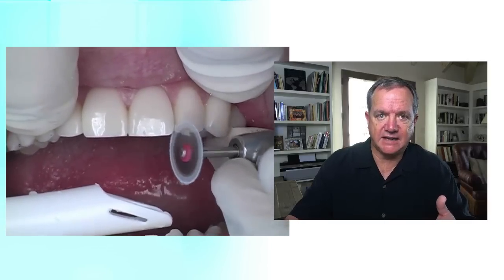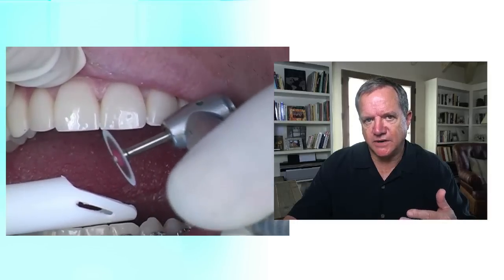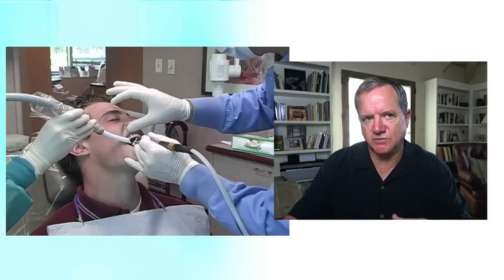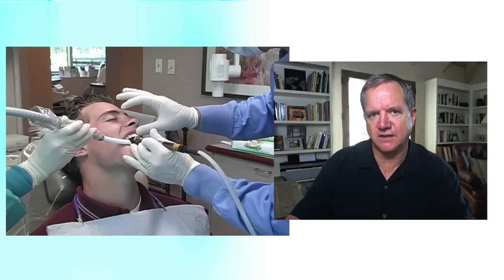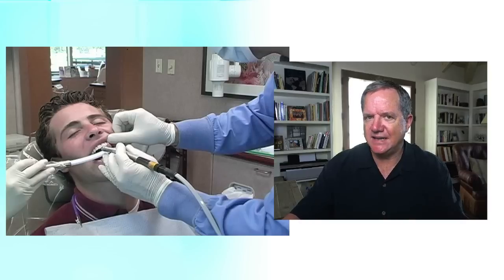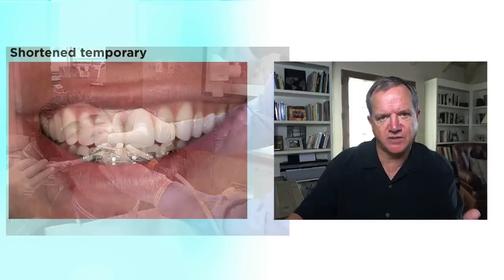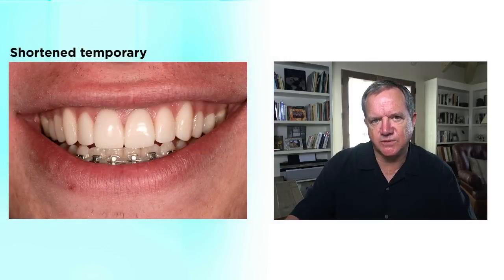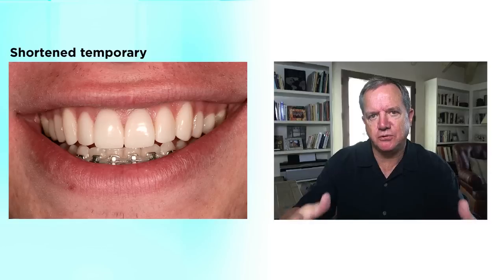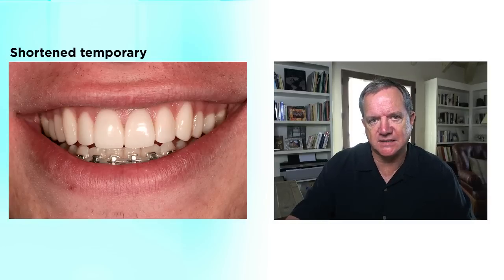Using discs in a contra-angle, we can start to recreate the incisal embrasure form. I really like these little diamond discs that fit in the contra-angle. We recreate the embrasure between the centrals, and recreate the embrasure between the laterals. This is a really important thing: my final embrasure and contouring I do with the patient sitting up a bit, and I stand in front of them looking straight down. When the patient is laying on their back it's really hard to see aesthetics. This is what the temporary looked like after we'd shortened it, put back in the embrasures, and polished it again using that rubber wheel. You can also use some of the discs you're used to working with for composites as well.